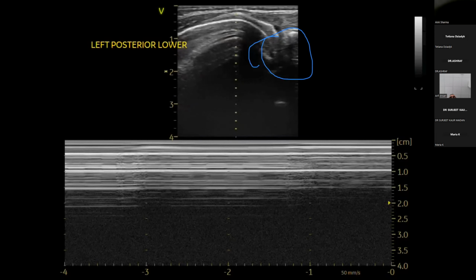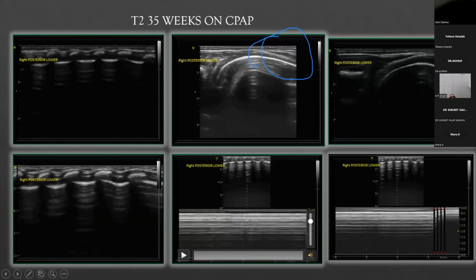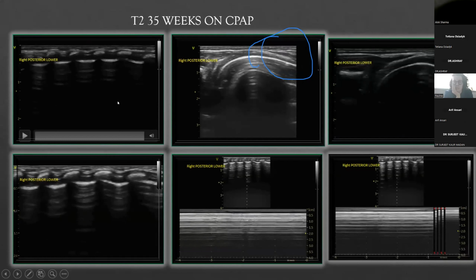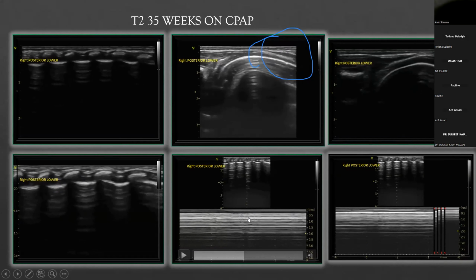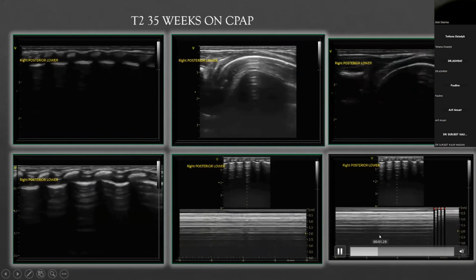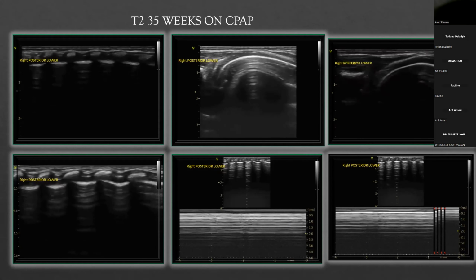I think the other twin has the same issue. Yeah, this one. See this nicely. This is nicely pleural sliding here, also over there, no doubt. Also here. Sorry, I'll just, this is rub. Also the same barcode. I think the depth is okay now here. I'd say till two, yes. After two, we have a lot of dropout, and that's what you're seeing in this region here.